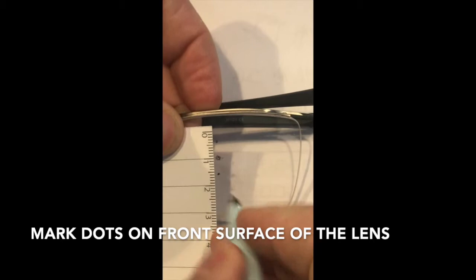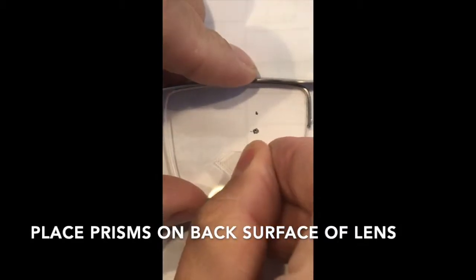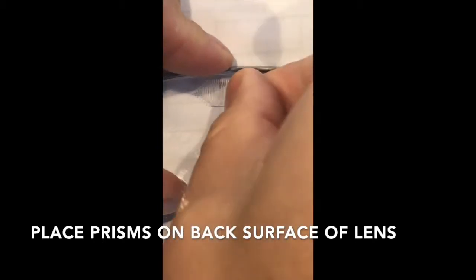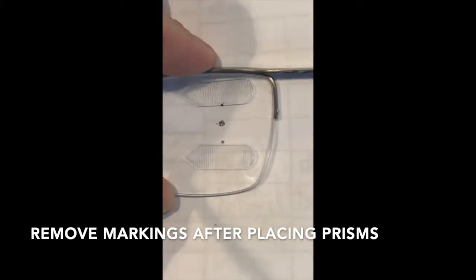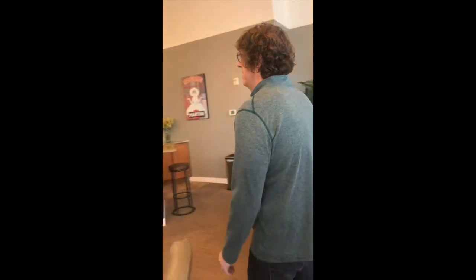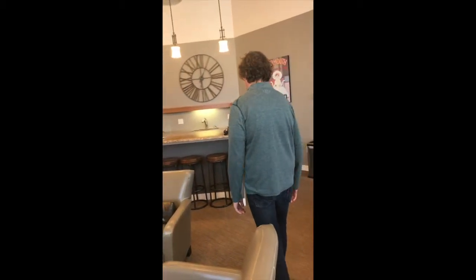Observe the patient's natural head posture prior to fitting the prisms. To fit the prisms, mark the pupil on whatever pair of glasses or fit-overs you are using. Place a prism six millimeters above the pupil and six millimeters below the pupil, base out on the side with the temporal field loss. Temporary prisms adhere best to concave surfaces, so place the prism on the eyeward surface of the lens. Make sure the prism location does not affect the patient's head posture; if it does, move the prisms but attempt to maintain the 12 millimeter separation.